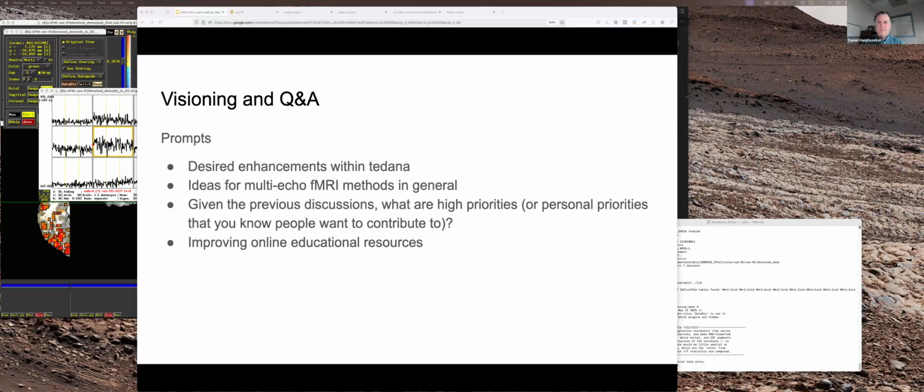I think we've definitely discussed that before. And it's on the long list, but maybe that could be one of the higher things. They're both a little bit tricky in practice, because when you remove drift, it's going to affect what PCA and ICA does, and we want to make sure we don't break anything. And censoring is very doable.